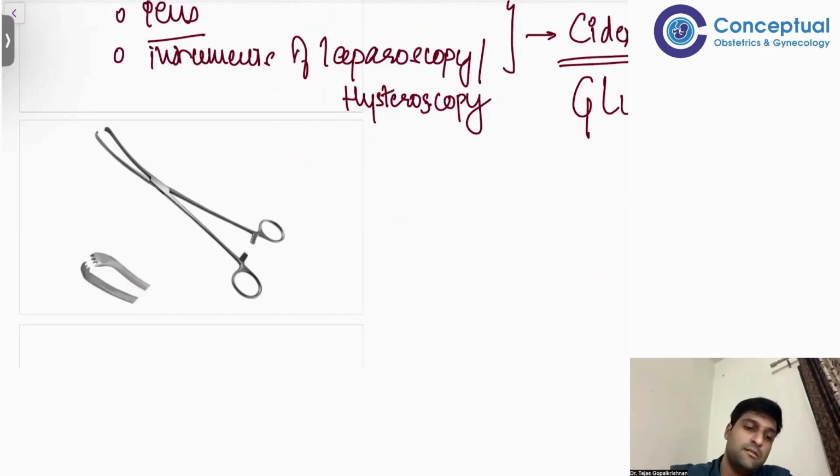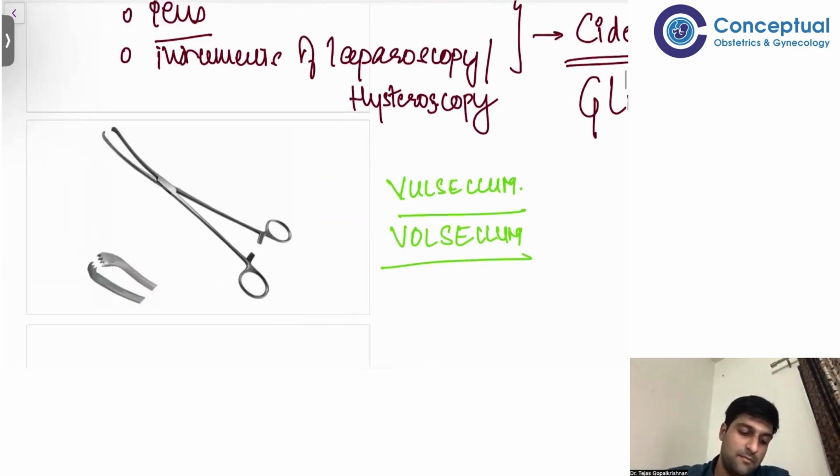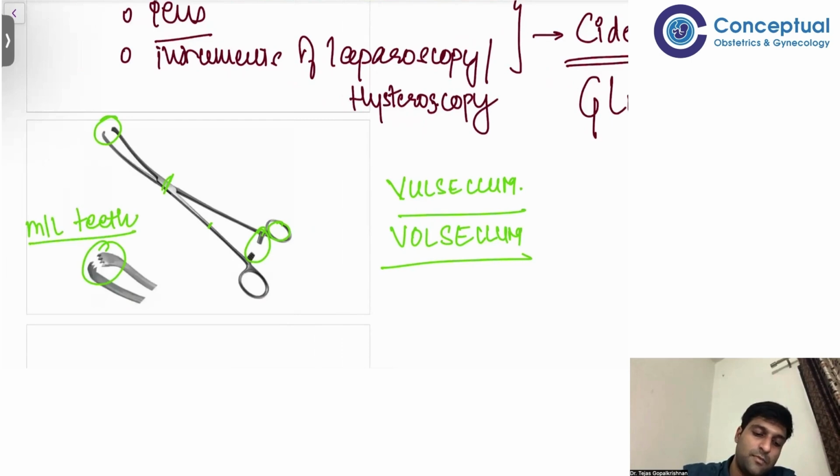This instrument is your favorite Vulsellum. Some textbooks call it Vulsellum, some textbooks call it Volsellum. Whatever you want to call it, it is Vulsellum. Okay, this Vulsellum has finger bows, then a ratchet lock, blades, and the tip has multiple teeth, right? Two, say three, teeth at the end to grasp something.